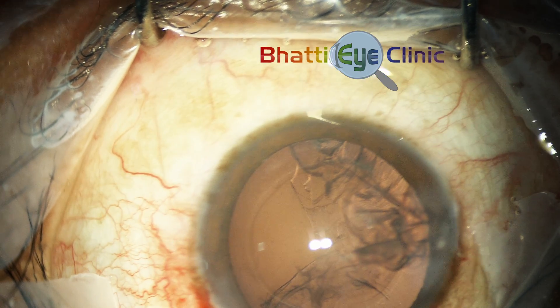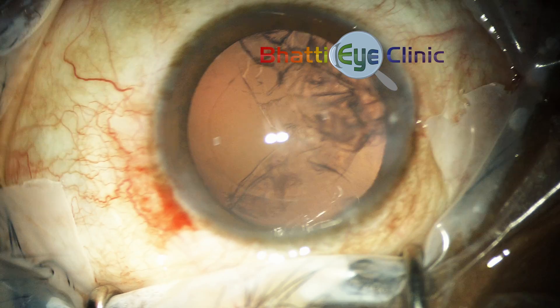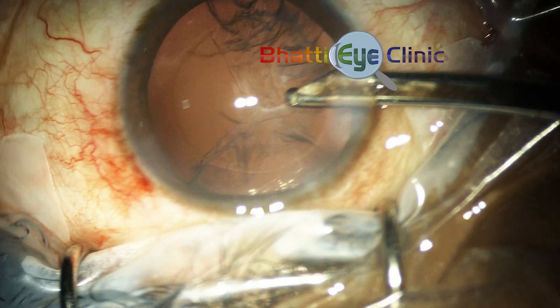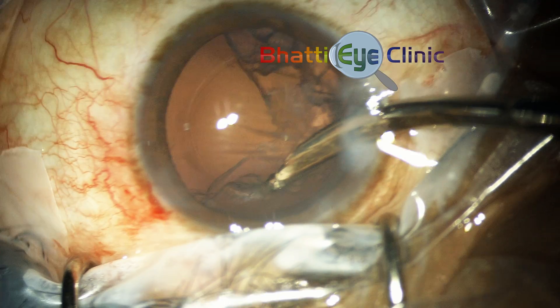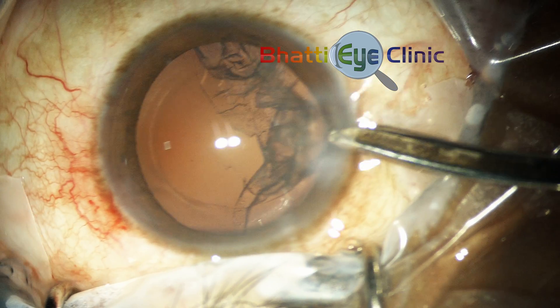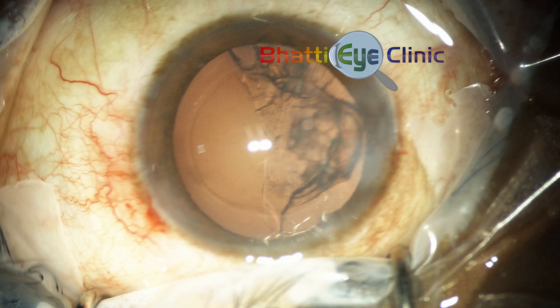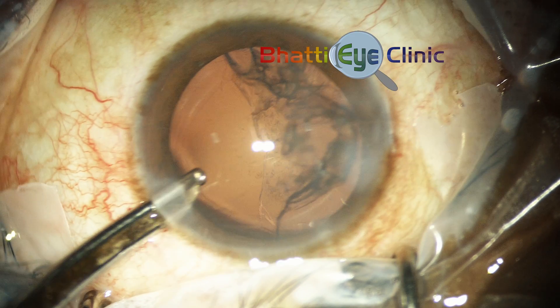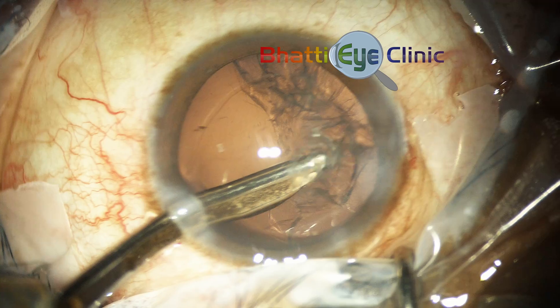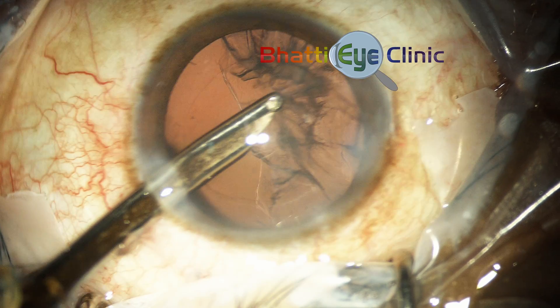In this case the irrigation aspiration cannula being used is a manual Simcoe irrigation aspiration cannula. It helps if the angle of attack for the cortex is from the diagonally opposite area. Hence it's helpful to have two side ports to do irrigation aspiration to attack the respective cortex in the opposite part of the eye.